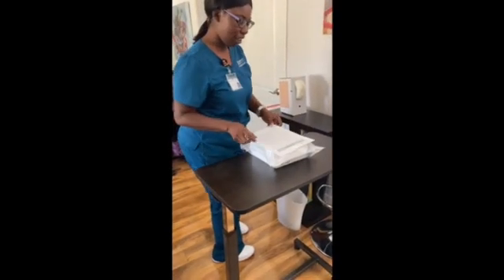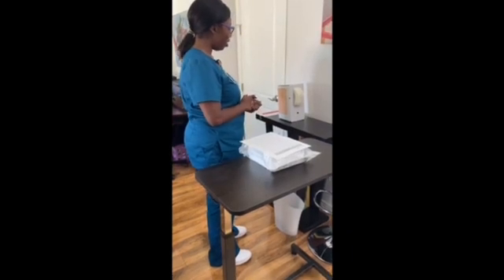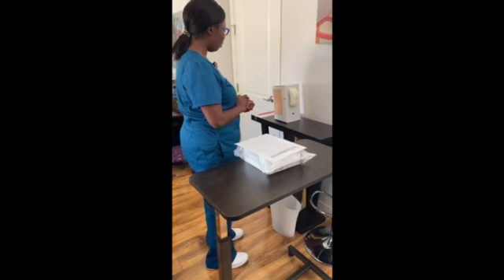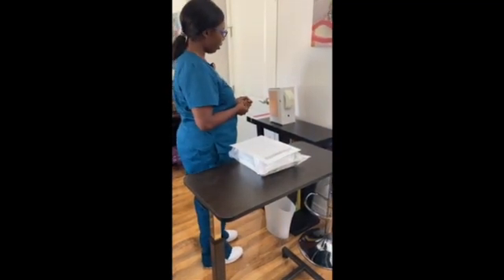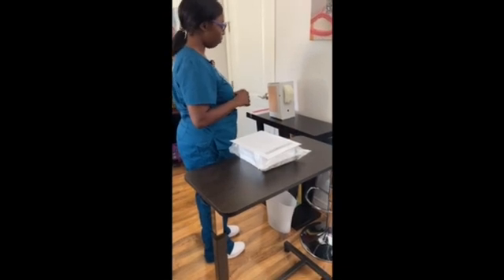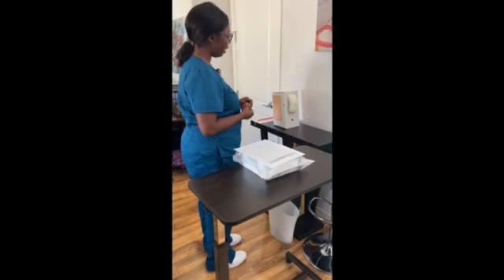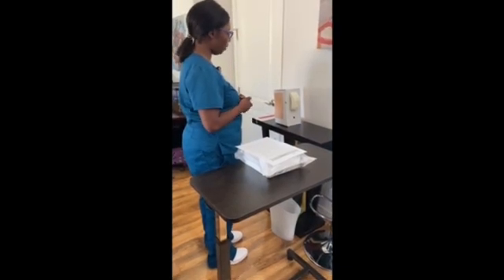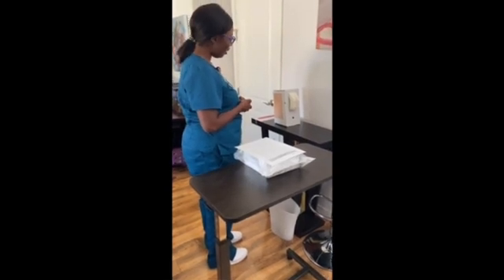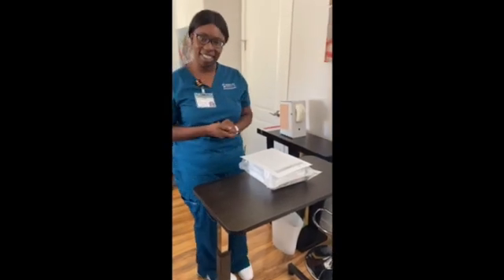So what the physician would like for me to do today is insert a Foley catheter. Have you ever had one of these? Patient states she has not had one. So because you're having some difficulty releasing all the urine in your bladder, a rubber tube will go up your urethra into your bladder that will help release the rest of that urine, so it could prevent any other complications with the urine staying in your bladder. Do you have any other questions? Patient states she doesn't have any other questions and she agrees to getting the catheter.